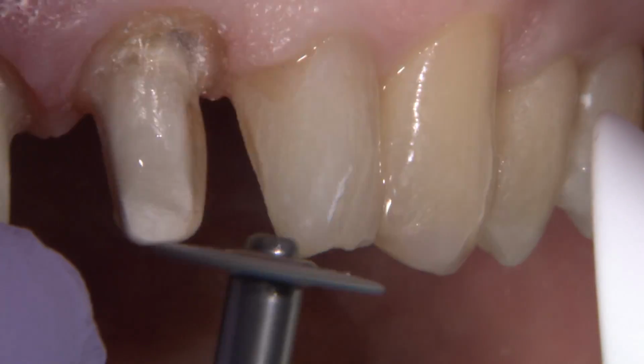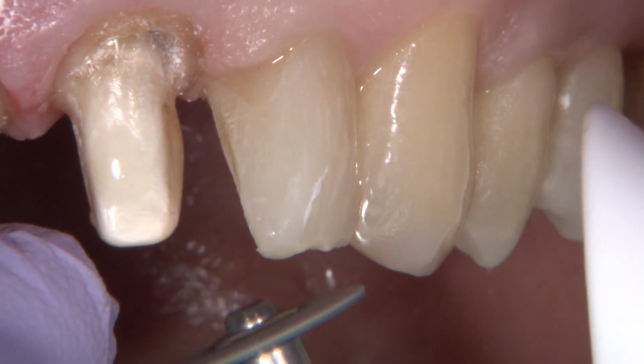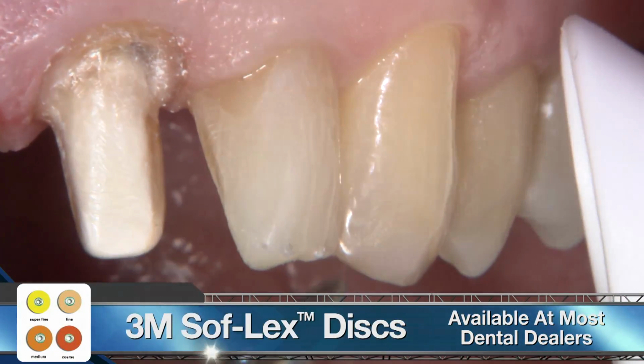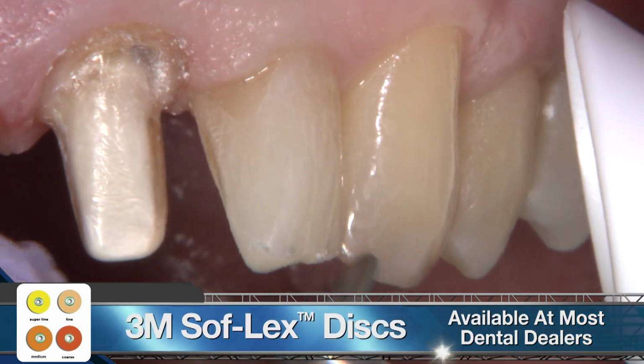To blend in better with our new restorations on 8 and 9, I do some incisal recontouring on the laterals with Soflex discs for a more youthful appearance.